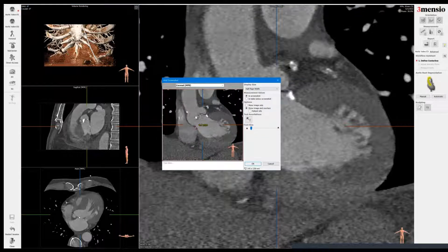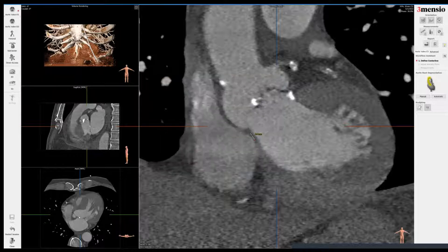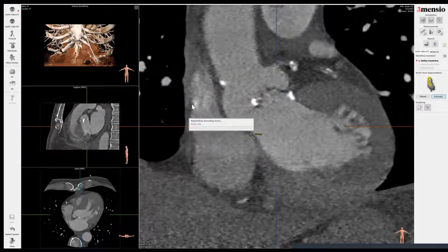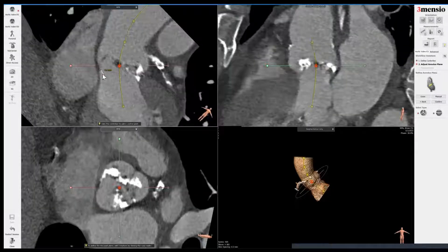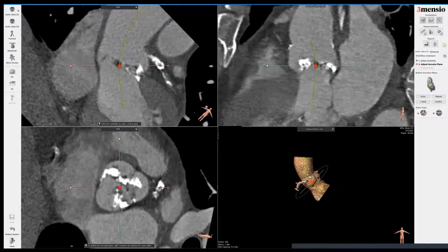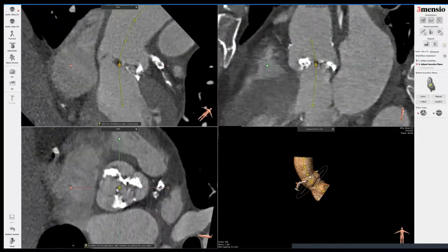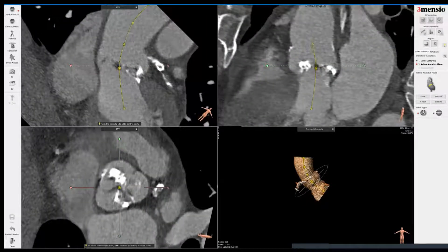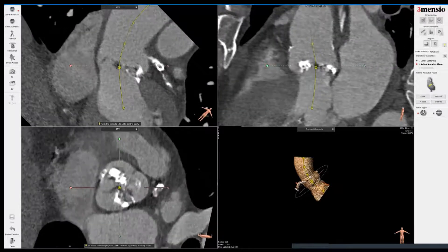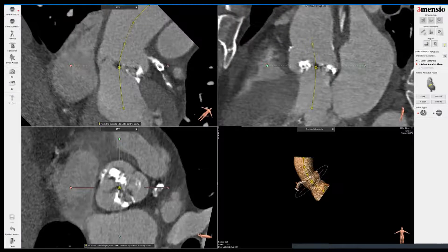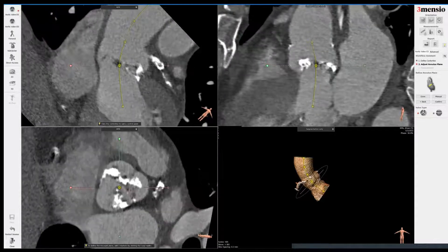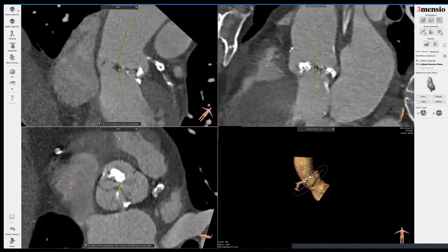You can see that here, and you can do your still shot. Next, I'm going to do the automated segmentation. You can see it's a very heavily calcified bicuspid valve just going up and down. You can see this is a calcified bicuspid valve with a right and left raphé fusion. So this is a Sievers type 1.